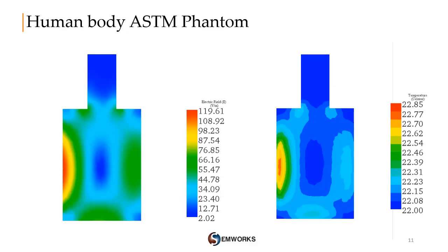Now for the electric field distributions, for an input power of 100 watts, and when exciting both parts with a 90-degree shift, it achieves a maximum field of around 120 volts per meter, and the temperature increases by 0.85 degrees inside the phantom gel, which is a very acceptable temperature increase. This is for a heating period of 15 minutes using a post-processing transient thermal solver of HFWorks.